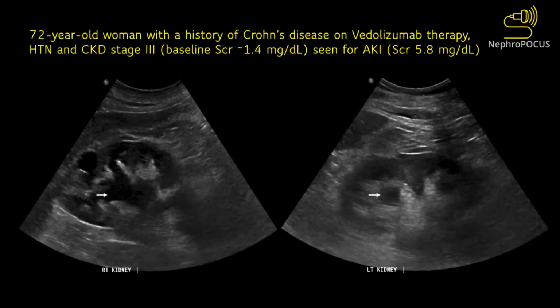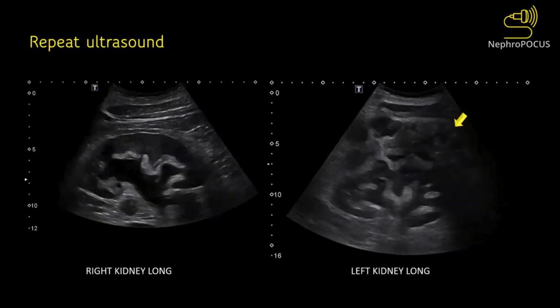Ultrasound was done, and it shows maybe mild to moderate hydronephrosis of the right kidney. And you probably see a small simple cyst. Other than that, really nothing remarkable. And the left kidney also shows mild hydronephrosis or some dilatation of the calyceal system. And nothing was really found in the bladder. But the patient was not really improving. The patient got a Foley catheter, and the creatinine was not improving that much as expected.